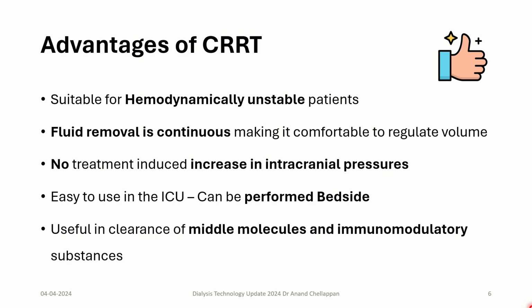These patients may benefit from CRRT, and in these patients performing intermittent hemodialysis is difficult. Now, fluid removal is continuous, making it comfortable to regulate volume. That is another advantage of CRRT.